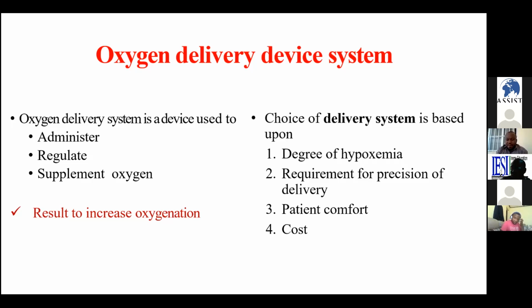Of course, make sure your patient is in a comfortable condition. Of course, don't forget to consider cost for your patient. Here, just about the cost, make sure you are using at the maximum of your available materials in the DH.